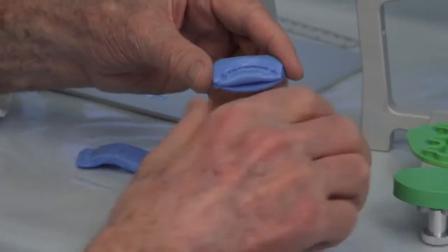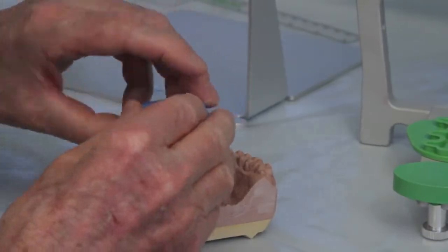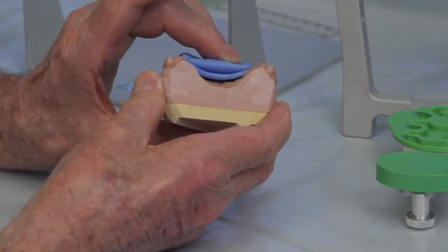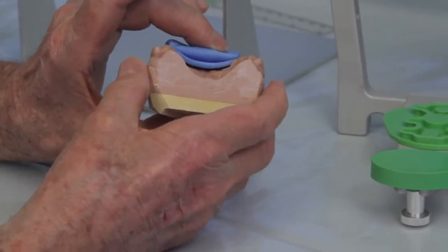And now I want to put it back on the model and see if I'm clearing the soft tissue good. I'm definitely clearing the soft tissue. And the wax doesn't rock. I can try to move it back and forth, it doesn't move. So I know that I've cleared the soft tissue good.